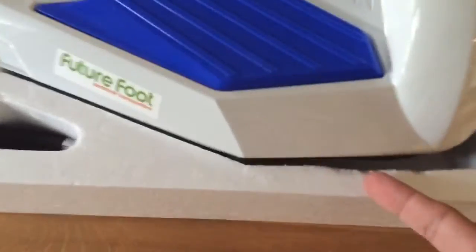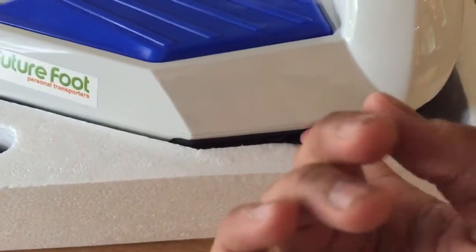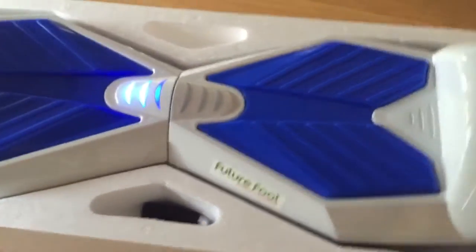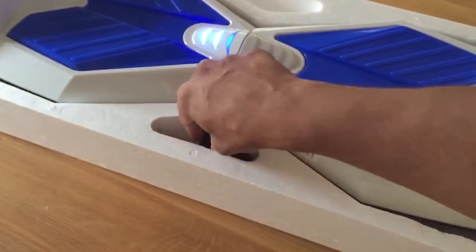Then on the back of the unit, what you're going to do is turn it on by pushing the button. Push it — there you go, it's on. And leave it in the box so you can calibrate it properly and it's level to the ground.